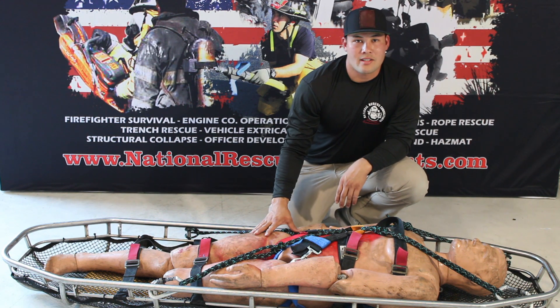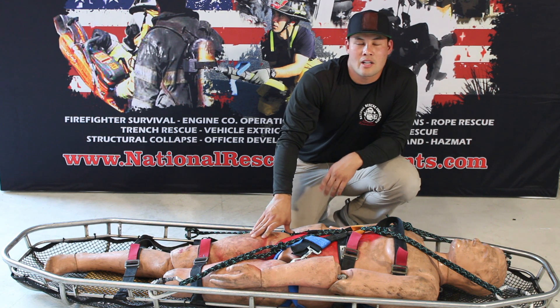Lightweight, easy to do, super fast — as you guys can see. Again, David McCullough here with TRT. Train hard and train to live.